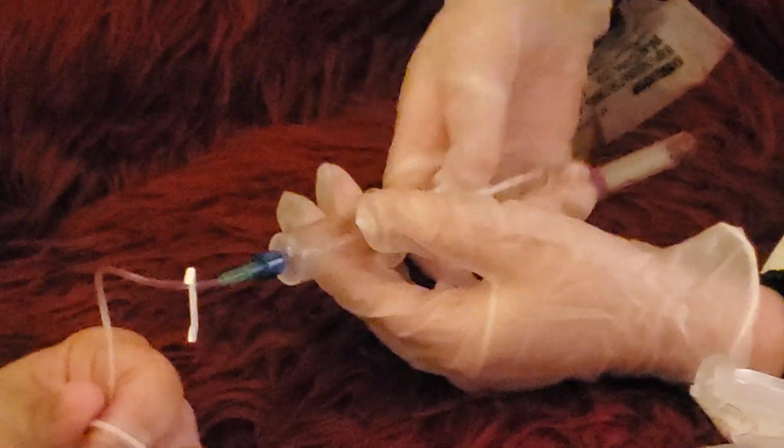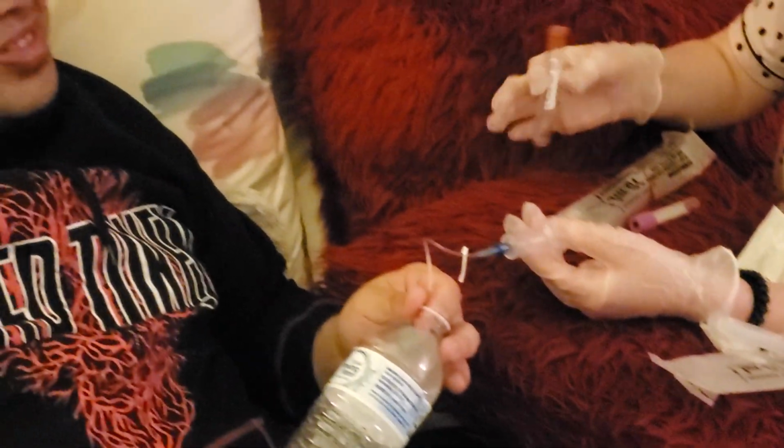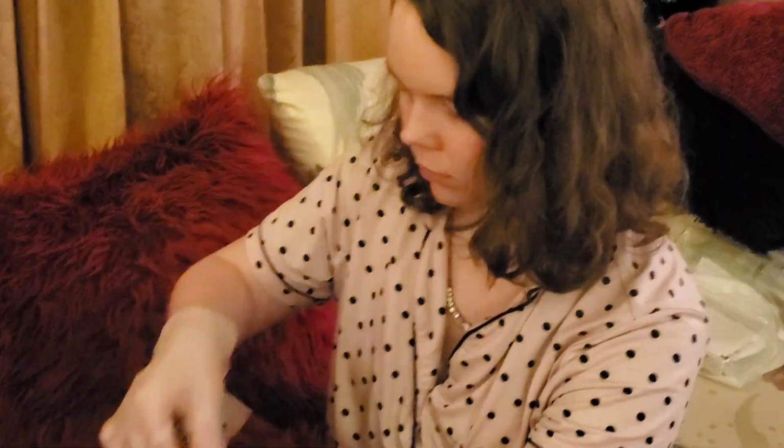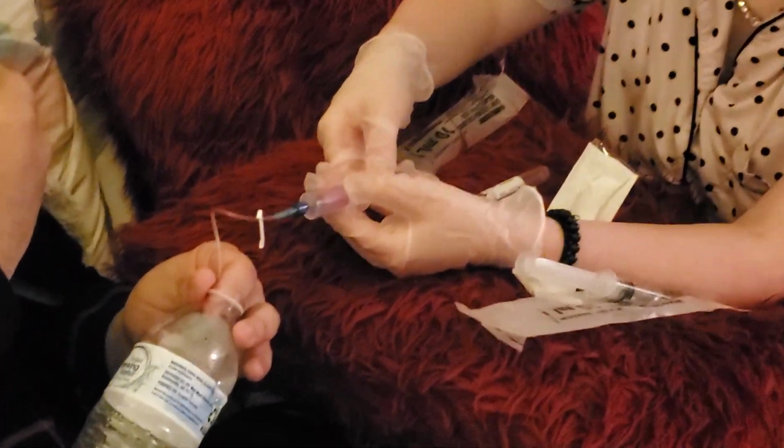That's the blood. Hopefully it doesn't make that noise. I'm going to slowly shake this to make sure it doesn't coagulate. Set that aside in the specimen bag. Same thing. Push. That's the blood filling up.